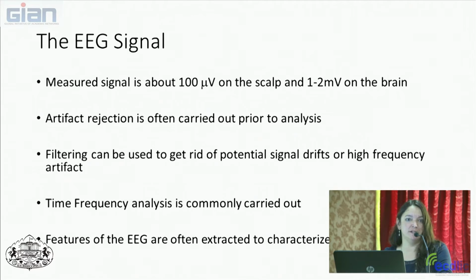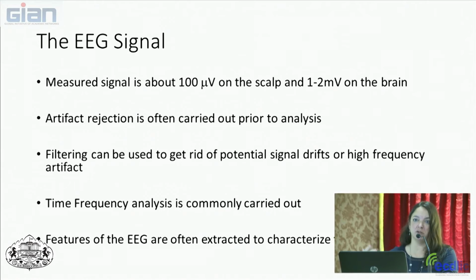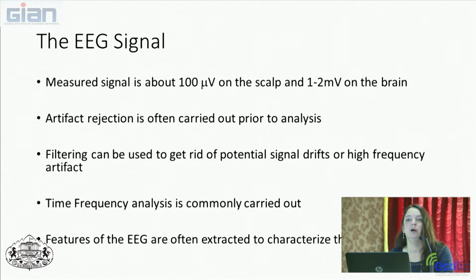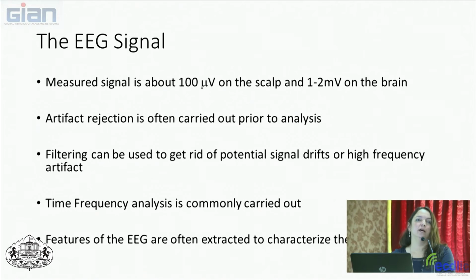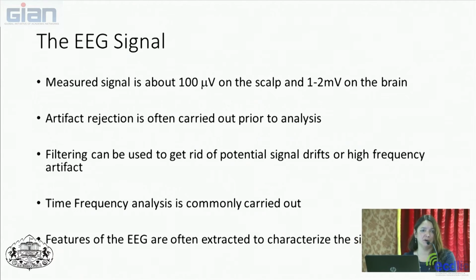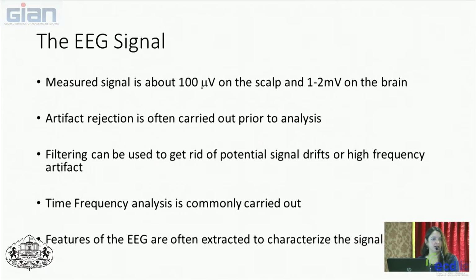And they do this actually by opening the scalp and having a person surgically place these on their head and then monitor them. And you think, wow, that's really an intense procedure. Why would they ever want to do that? Well, that's done in the cases of especially children who have severe epilepsy and have trouble functioning from day to day because they're having so many seizures.